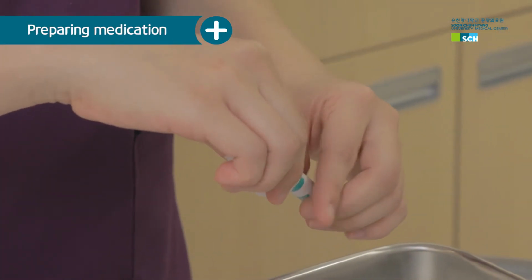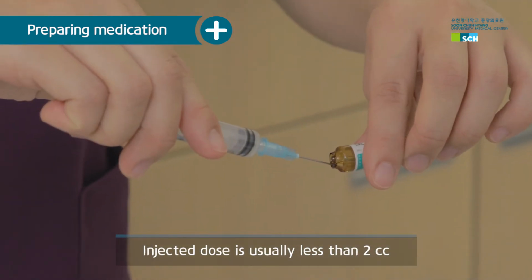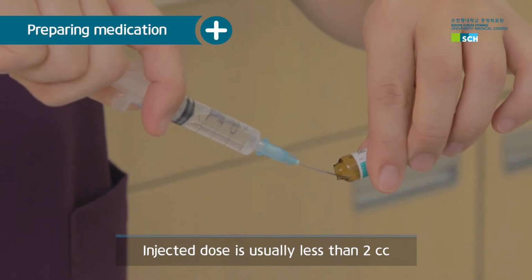Prepare medication in a syringe. The amount of IM medication is usually less than 2 cc. If the amount is more than 3 cc, it will cause significant pain in the muscles.